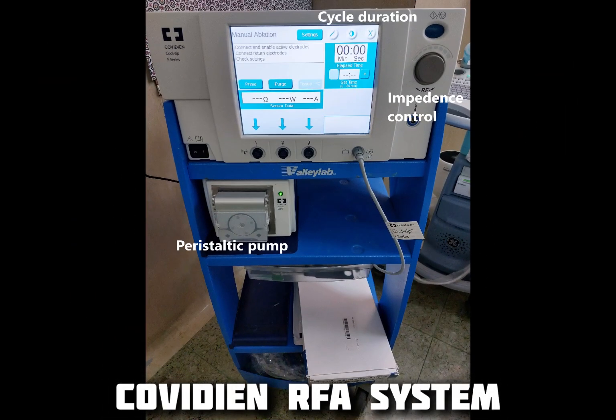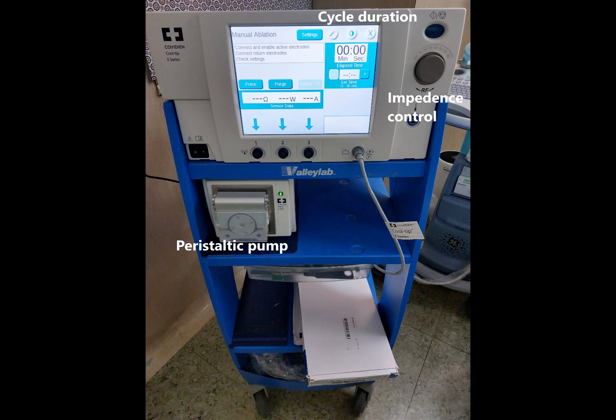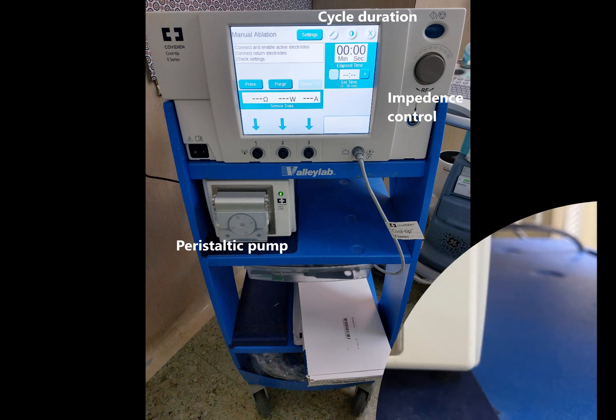This is the RFA system. The duration of each cycle is shown on the top right panel. The second assistant needs to adjust the impedance control during the procedure to deliver the targeted energy. You can see the peristaltic pump located at the bottom left of the screen. The system is completed by a grounding pad placed on the patient.